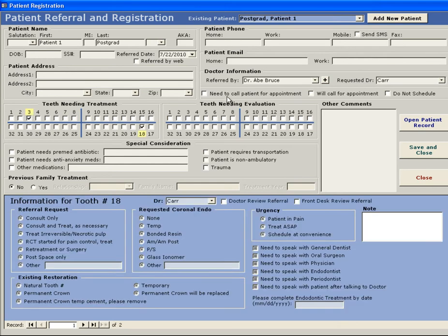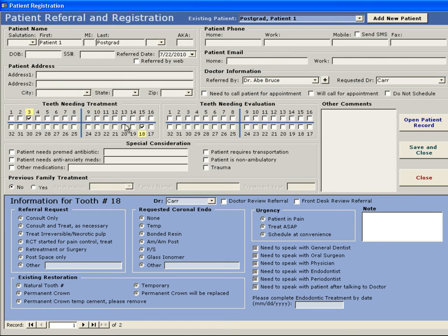You can fill in the referring doctor, as well as enter teeth that need to be treated. By entering teeth on this Needing Treatment section, this will add the tooth to the patient's chart.